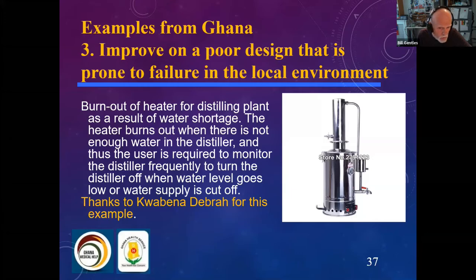When you make demands on the users that require repeated attention to a rather uninteresting task, it's asking for the users to not pay attention at the critical time and cause failure of the device. So this was a poor design. It needed to be fixed, otherwise they were going to repeatedly have failures of the heating element.